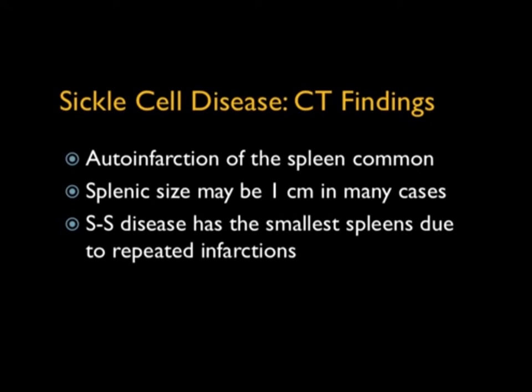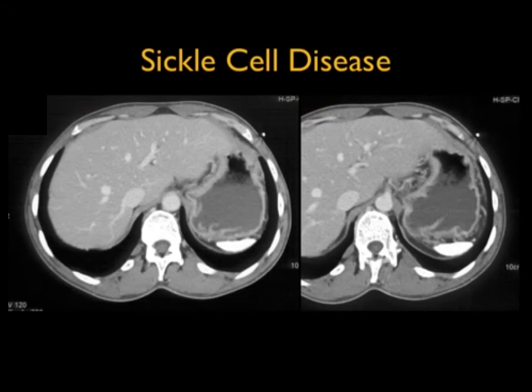Maybe a big liver, maybe a dense liver, but small spleen, densely calcified. You'll see obvious bony changes as well with sickle cell disease. Beautiful example there, or here, pleural effusions. Very dense calcified spleen, very small. Sometimes it's barely a sliver, and I've seen people say there's no spleen present.